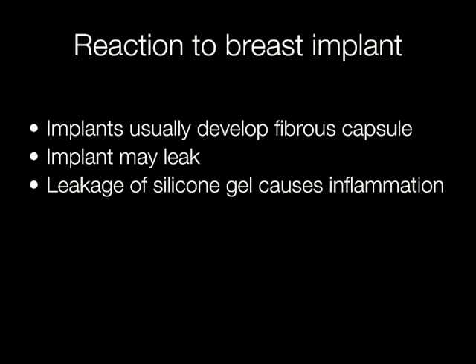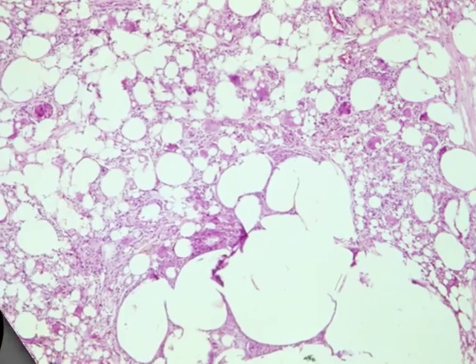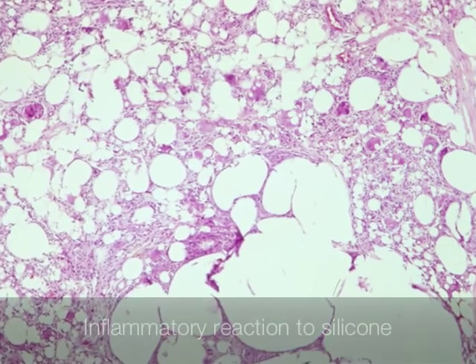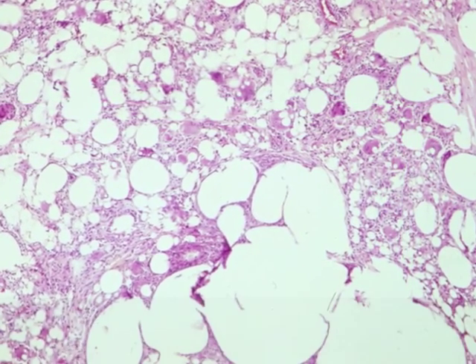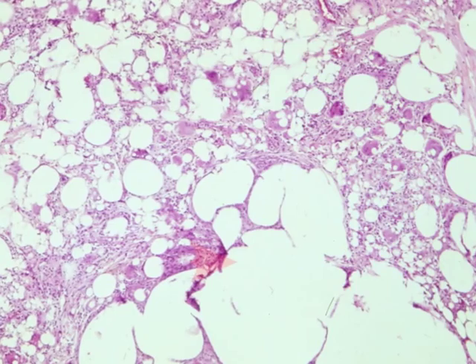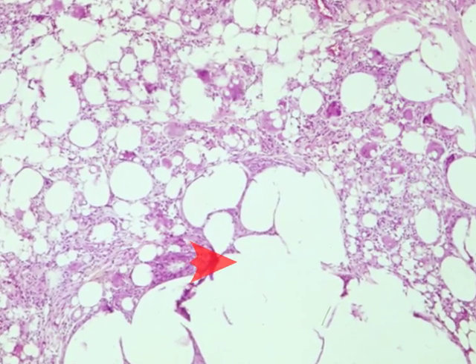Breast implants cause a fibrous capsule to develop. The implants may leak, and leakage of silicone gel, for example, causes an inflammatory reaction and a foreign body giant cell response. Here we see an inflammatory and foreign body giant cell response to silicone from a leaking implant.